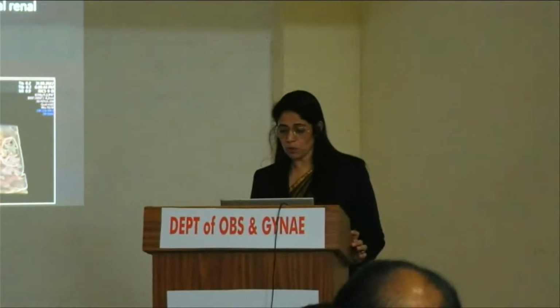From the fetal abdomen, we have to document the fetal kidneys. These are bean-shaped, slightly echogenic, with a hypoechoic central renal pelvis. And sometimes, if we look clearly, we can even document the hypoechoic adrenal glands on the superior aspect of the kidneys. We can detect multicystic dysplastic kidneys at a very early stage. So this was a case where both the kidneys had multiple cysts, seen in the axial and the transverse plane, and we did a 3D of it, and the cysts can be clearly seen, the kidneys are enlarged.